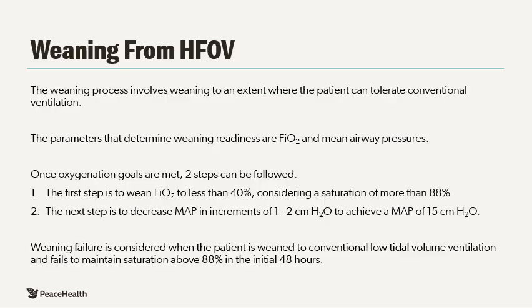Weaning from high-frequency oscillatory ventilation is not based on a fixed protocol, and various methods are followed. The process involves weaning to an extent where the patient can tolerate conventional ventilation. The parameters that determine weaning readiness are FiO2 and mean airway pressure.